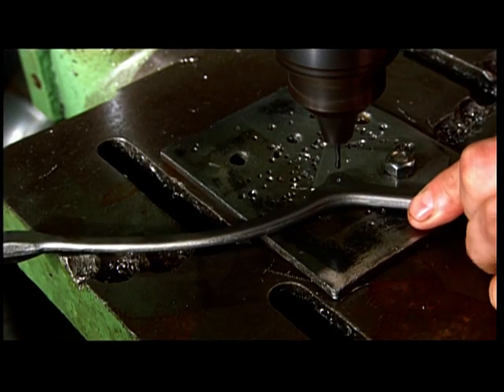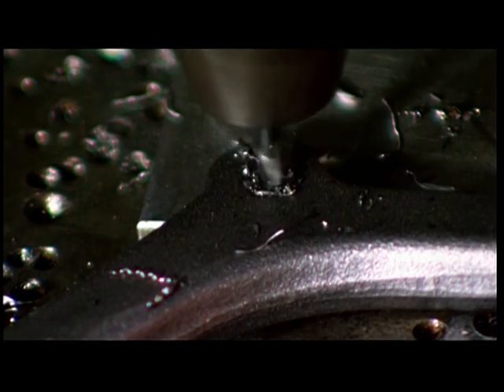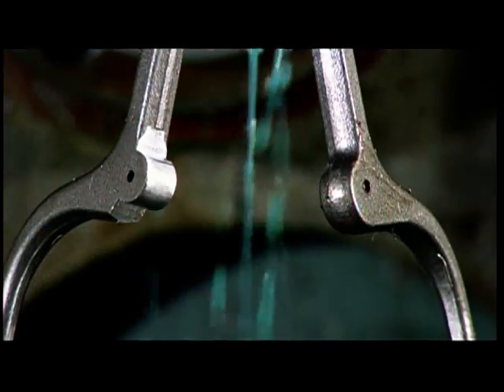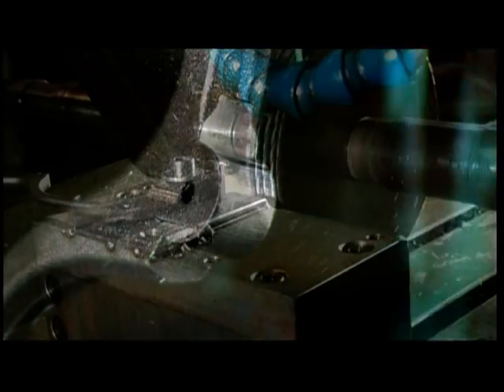One of the more useful tools is a self-retaining retractor, which is used to pull back tissues or organs during surgery. Using a circular cutter, they round the profile of the tool's joint. This round joint allows the tool to open when the shanks are shut, the opposite of a pair of scissors.